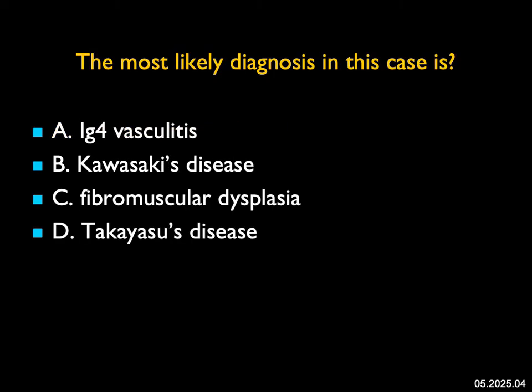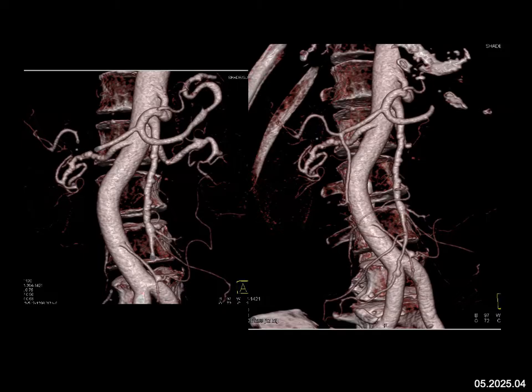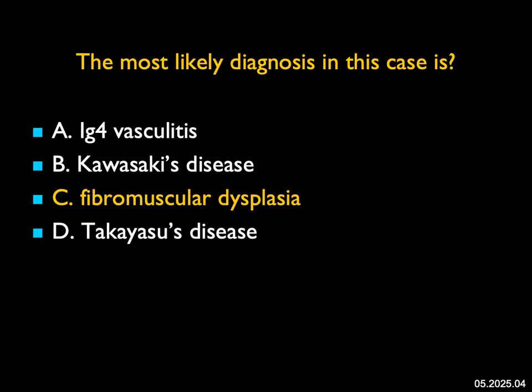The most likely diagnosis in this case: I see two findings. The first on these volume-rendered images is beading of the right renal artery, and the second is beading of the SMA. There may also be subtle beading of the left renal artery. The vasculitis that gives you beading is fibromuscular dysplasia, which often involves multiple vessels including the carotid and renal arteries. Takayasu's is large vessel disease, typically the left subclavian. Kawasaki's, we think about the coronary arteries. IgG4 can involve multiple vessels but usually causes vessel thickening, not this beading appearance. The most likely diagnosis is FMD, or fibromuscular dysplasia.